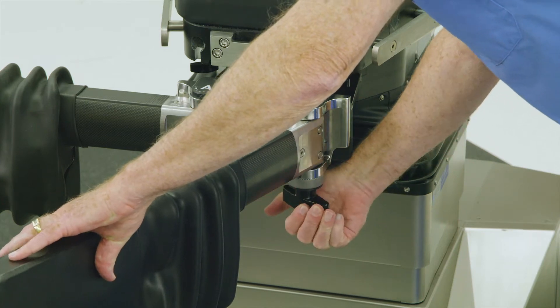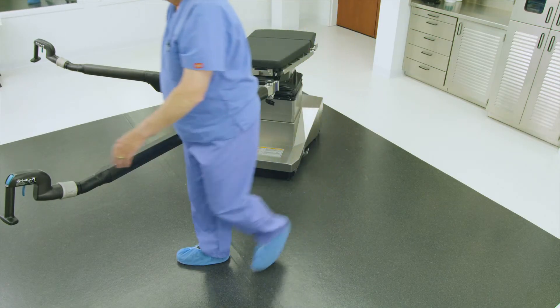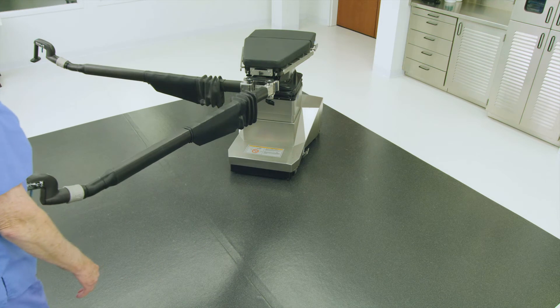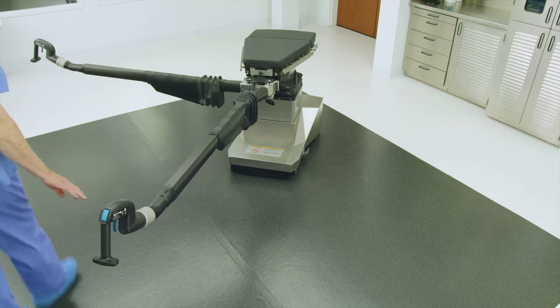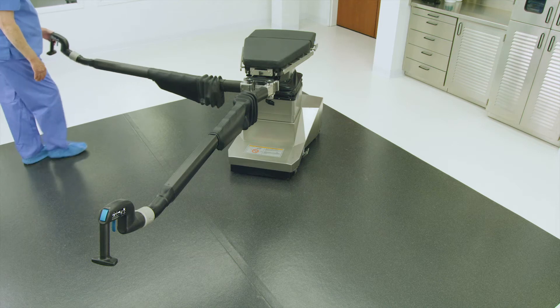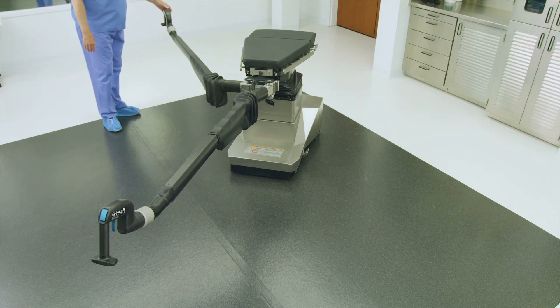Adjust the patient's left leg abductor spar using the control handle as shown here. Fold the patient's right leg abductor spar back toward the table to about 45 degrees, allowing room for the anesthesia provider.